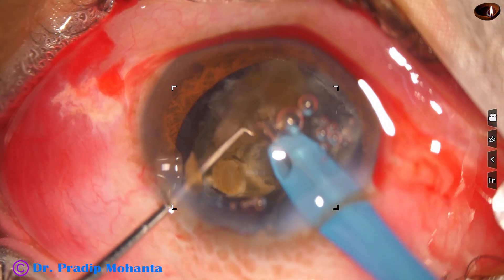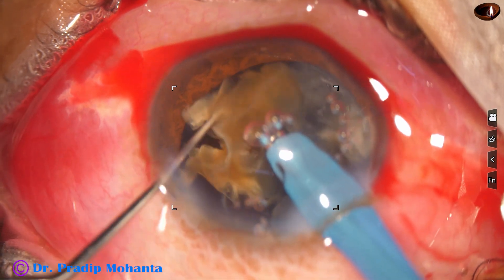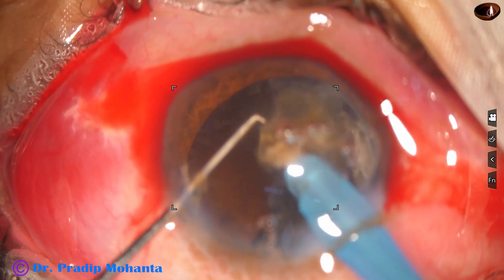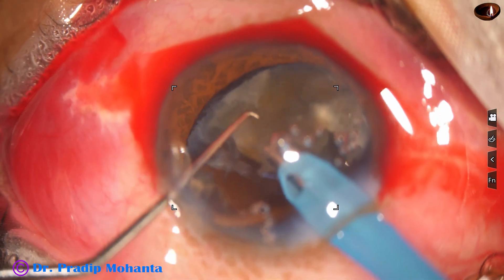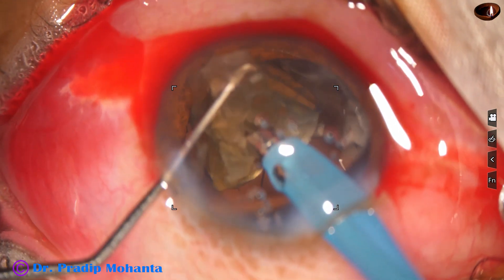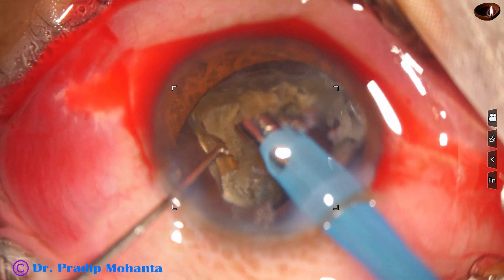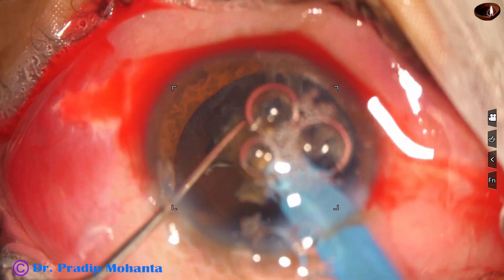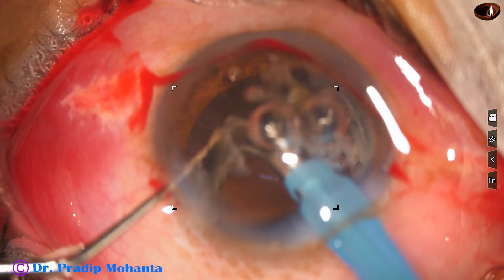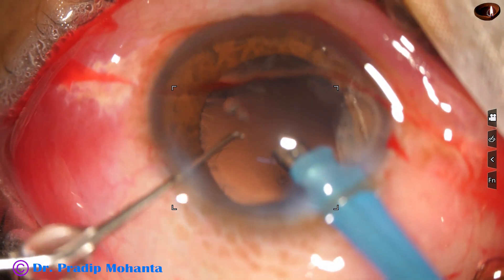Emulsification is done in continuous mode but the ultrasound is applied intermittently. This is the base — the last nuclear base. At this time it is safer to scaffold if our intuition says so, or if we see that the posterior capsule is coming forward. But in this case I find that the posterior capsule is pushed far back, so I emulsify the base. At this time, the parameters are also reduced. This is the last piece of the nucleus — it is emulsified.